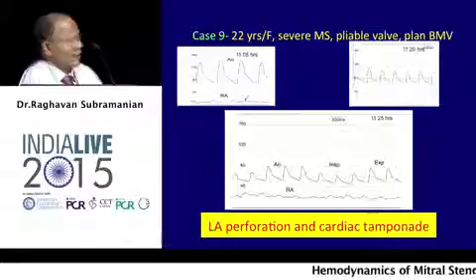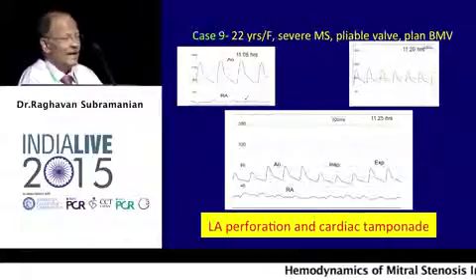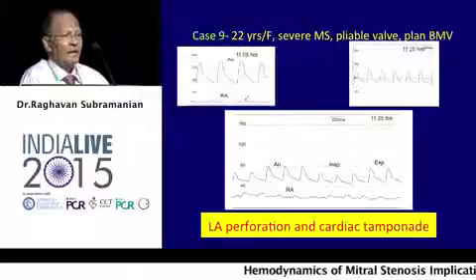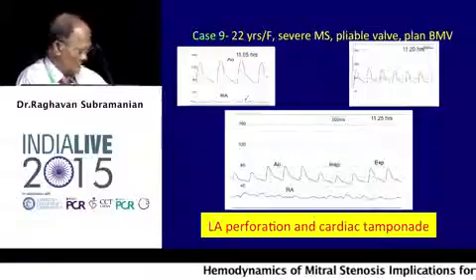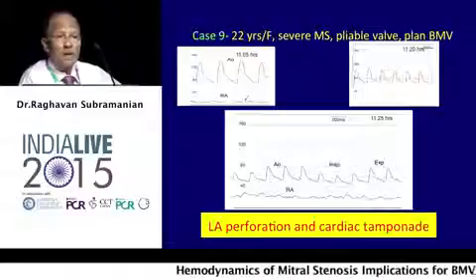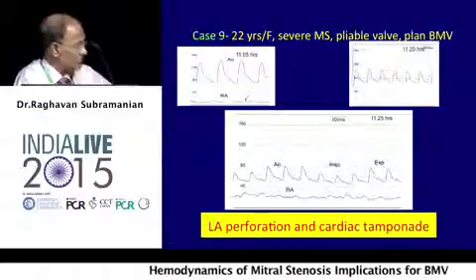And when you're doing this and you have a perforation, your whole attention is on entering the LA and on crossing the mitral valve. Early tamponade is often missed till bradycardia or hypotension occurs. Now, keep an eye on the hemodynamics, or ask your assistant to keep an eye on hemodynamics to detect complications earlier. So hemodynamics is critical for the early detection of tamponade and complications.